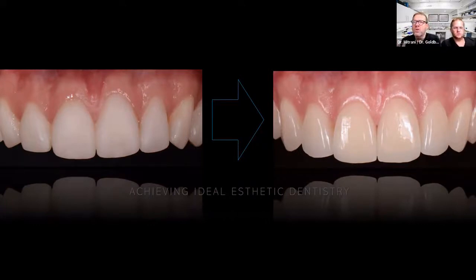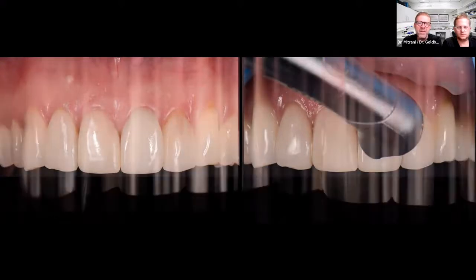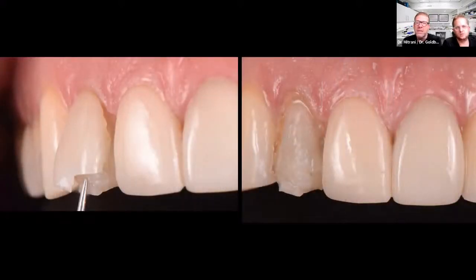But the bottom line here is utilizing the laser unit to be able to retrieve the veneers as minimally invasively as possible. And by the way, from a patient communication standpoint, patients really appreciate that we're utilizing a technique that allows us to retrieve the veneer with the least invasion. Again, not that it was wrong removing it with a conventional high-speed handpiece and a burr. The problem, though, is you ultimately end up, even if you do it as carefully as possible, removing some sound tooth structure, right?